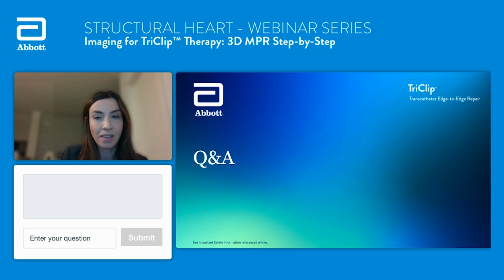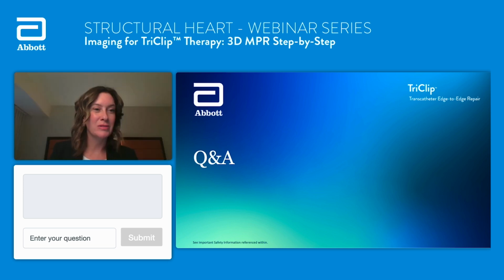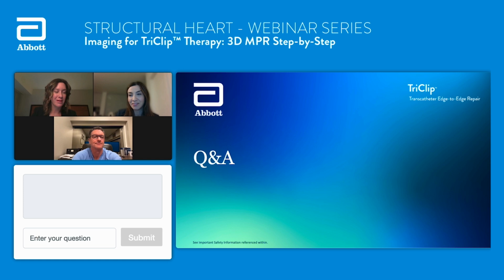Thank you, Dr. Safi. That was a great run through in detail on MPR. We really appreciate the tour here. We do have a few questions as it relates to MPR. So our first one here: can you elaborate on if an MPR from a transgastric view is more ideal for grasping view rather than utilizing the mid-esophagus view to generate an MPR?